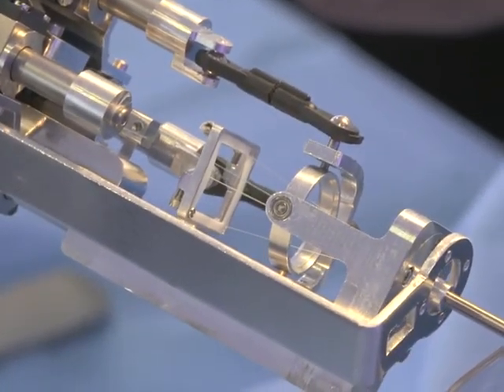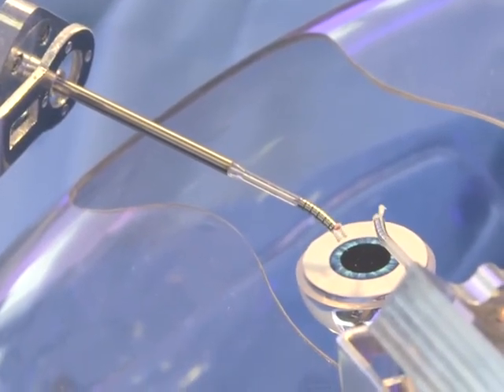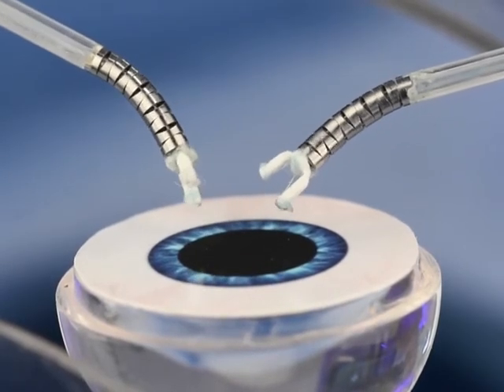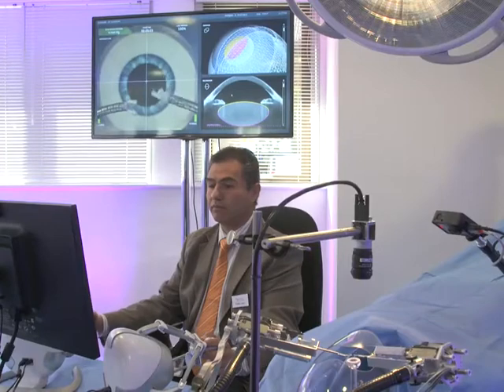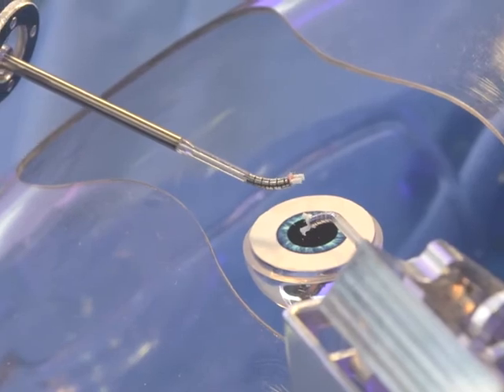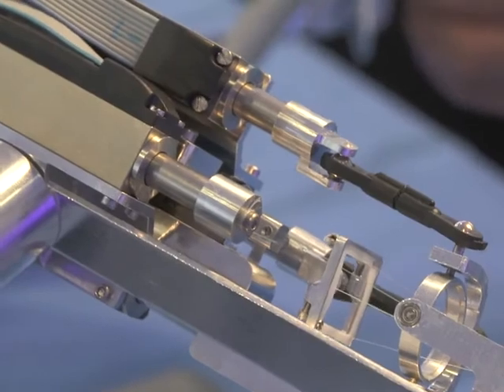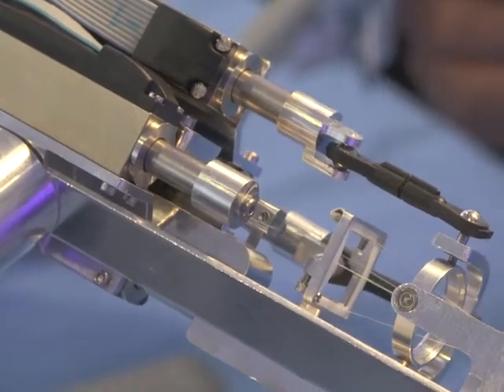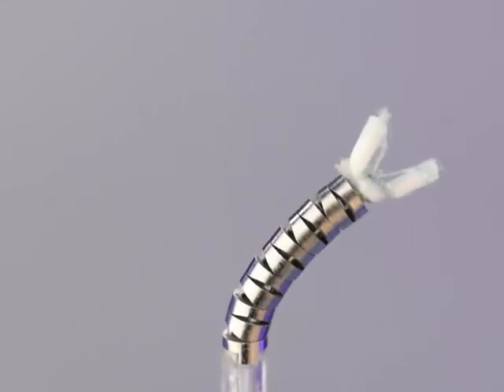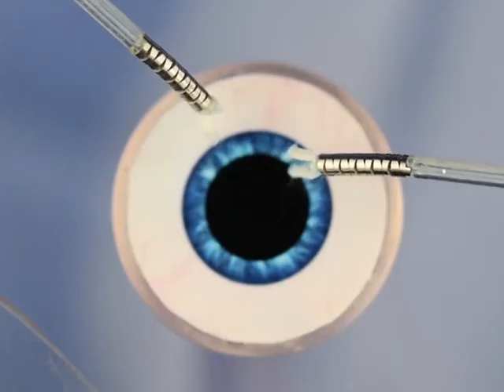Right, yeah. So there are a number of trade-offs, and our Axis system represents one particular set of trade-offs, and there's maybe a more advantageous set of trade-offs, but there are always going to be trade-offs pushing you either which way. One of the trade-offs making current robotics big is this serial chain of motors and links. Let's say you've got to hold this tool up above the patient, and you want that to be robotically positioned. The way that the current robots are designed, mounted to the floor, there's a motor, and then there's a link, and there's a motor, and there's a link.